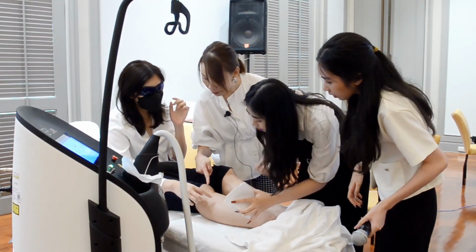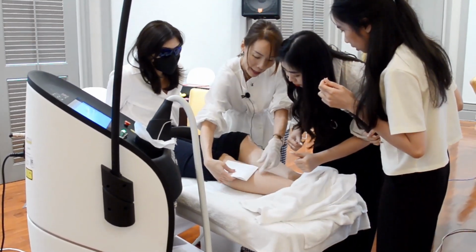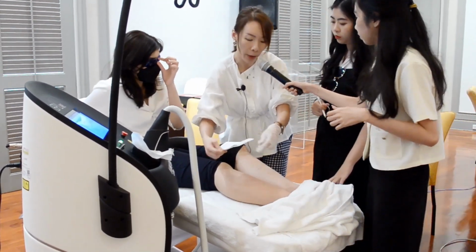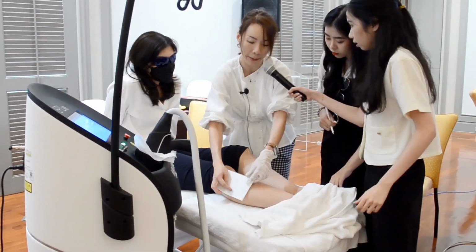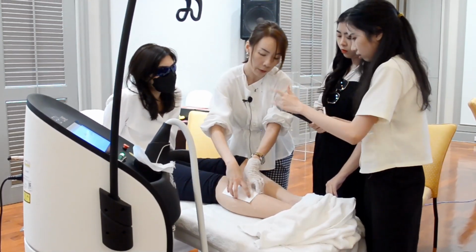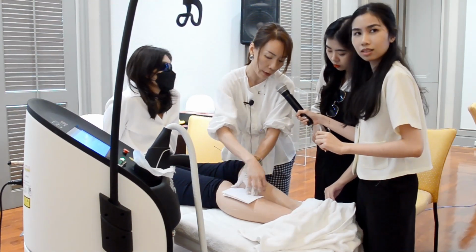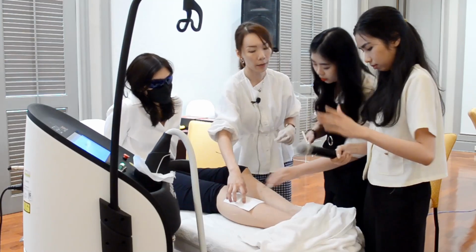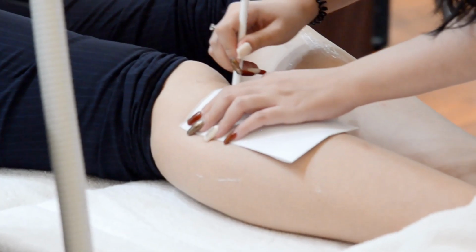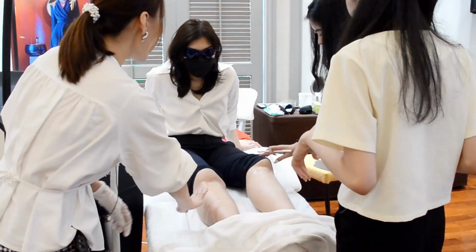You've shaved already, right? This area? Yeah, so you can also do it, but not so far, because I just did here, so you don't want to leave a gap. You will be close to it. So do note that when you are drawing the areas, please do not leave gaps all over the place, otherwise you have untreated areas. So when you draw the next one, your rectangle has to be close to the next one. So you draw over here. Just do here will do.